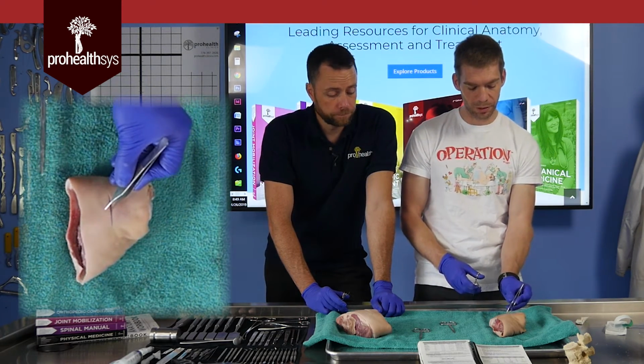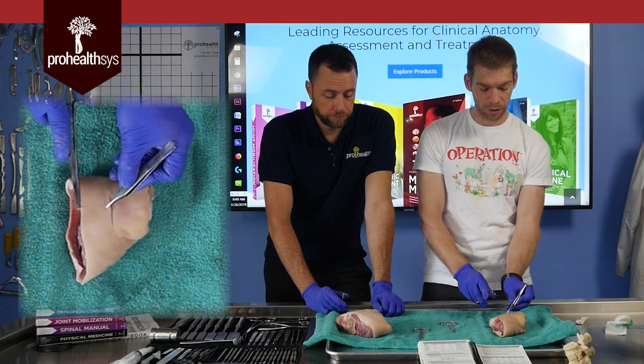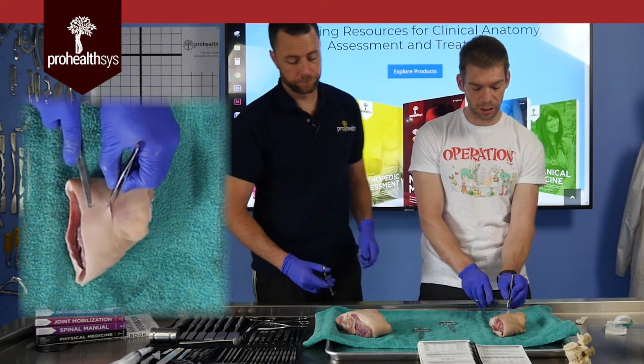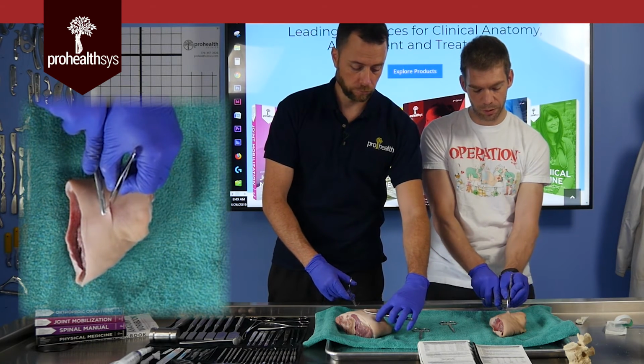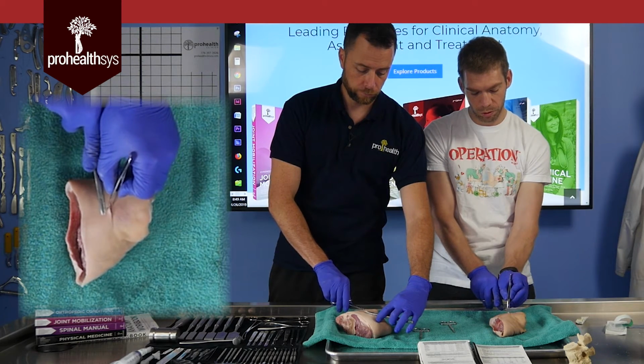So there's going to be two techniques here, and you'll see me do one technique and Dr. Vizniak do another, and they're both right. What you'll do is you'll grab onto the skin, you'll evert it just a little bit, so that when your needle hits that tissue, the needle's kind of at a 90-degree angle. And then I'm going to start about 2 to 3 millimeters away from the edge.